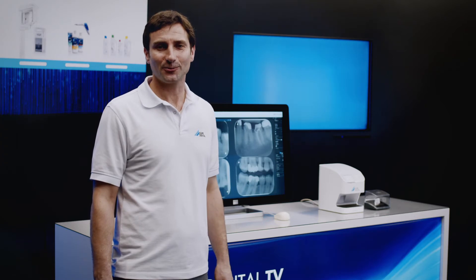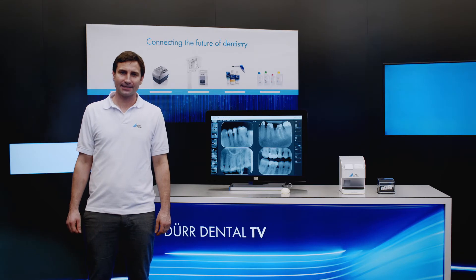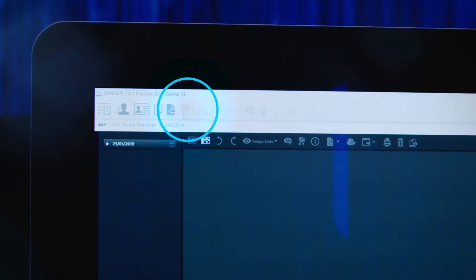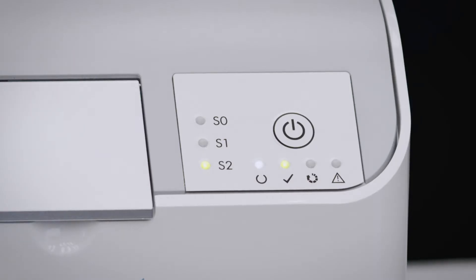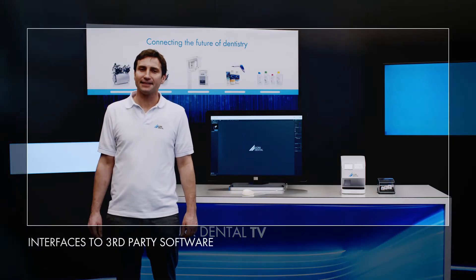VistaSoft is the all-in-one imaging software from DoorDental. To import an exposed image plate, users normally activate the software via an interface in the patient management software using the patient who is already logged in. Simply click on the intraoral x-ray module and VistaSoft connects to the scanner over the practice network. With the aid of the supplied interfaces VistaEasy, ImageBridge and Twain, VistaScan NanoEasy can also be operated using any other standard image processing software.